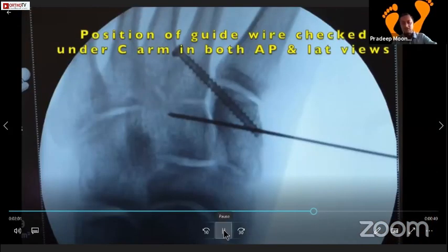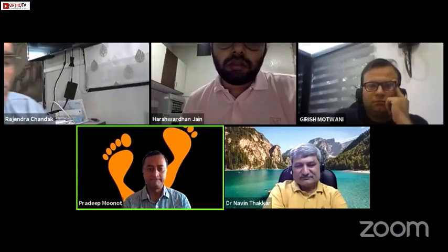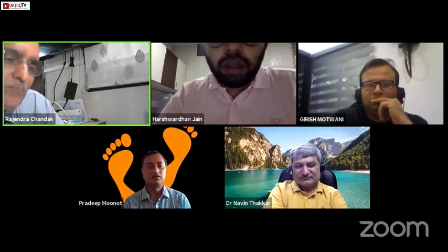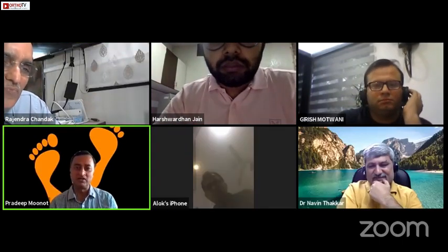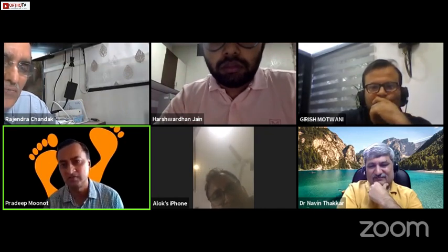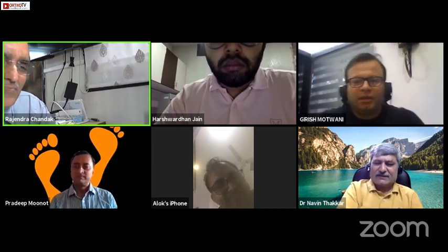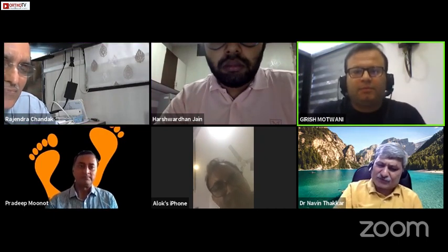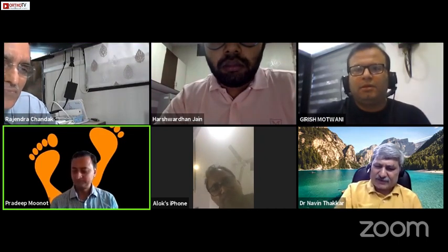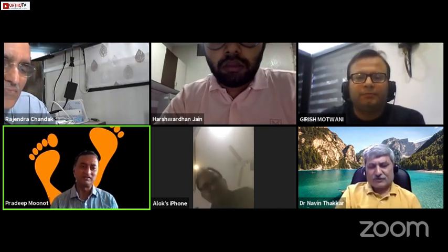That's your intact cuneiform - I think that's fine. The screws we use are mostly titanium. I always use titanium because you don't want to drill or tap - these are cancellous bones so that should be okay, except for the metatarsal where you may just want to ream the cortex initially. These are self-drilling screws - Stryker and even Indian companies do it now. Sometimes we have poor patients, so cost optimization matters.